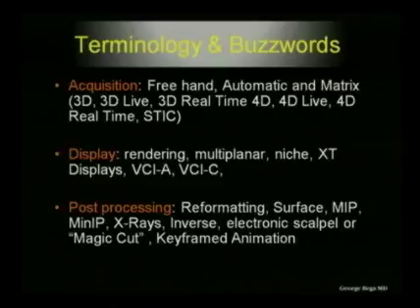Of course, you can acquire a volume either once or in continuity. Now, some of the variations of the acquisition of the volumes are STIC. STIC stands for Spatial Temporal Image Correlation. It is a dedicated package to acquire volumes of the fetal heart.